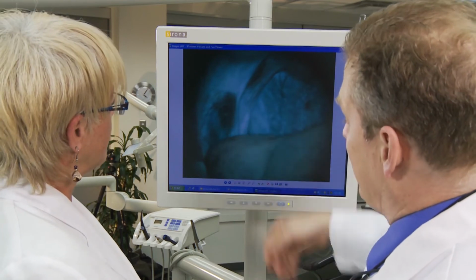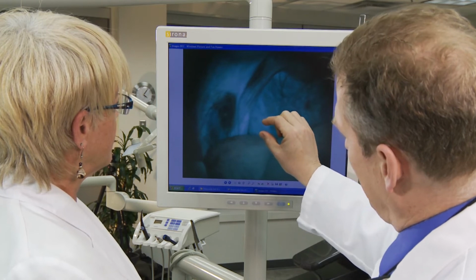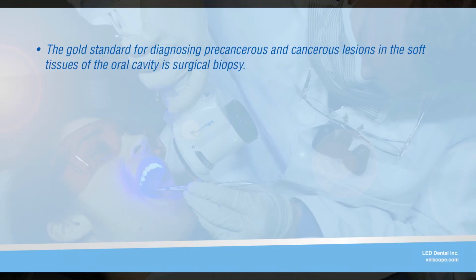Persistent abnormal findings should never be ignored, and should be followed until they either resolve or their cause is well understood. Emphasize to the patient, however, that persistent abnormal findings do not necessarily indicate cancer. If the patient cannot make a follow-up appointment, or if the dentist feels that the patient is unreliable, immediate steps are advised, including immediate biopsy if possible, or referral to their primary care provider or a specialist.